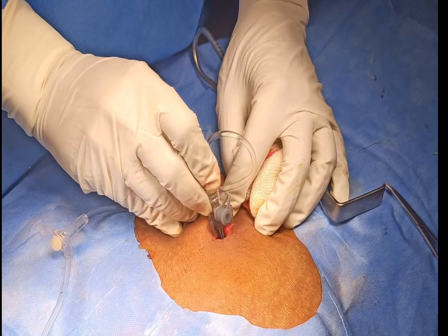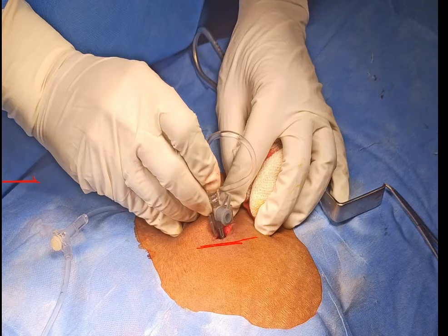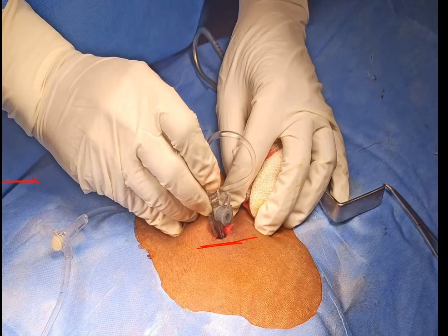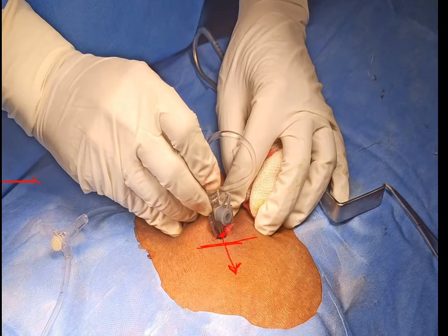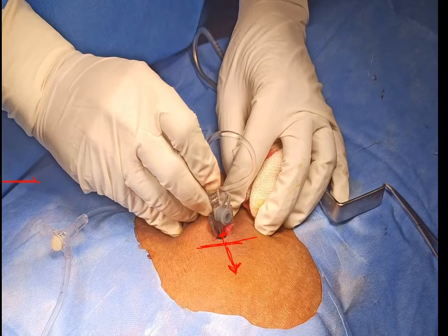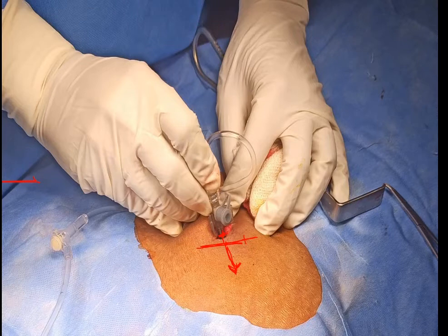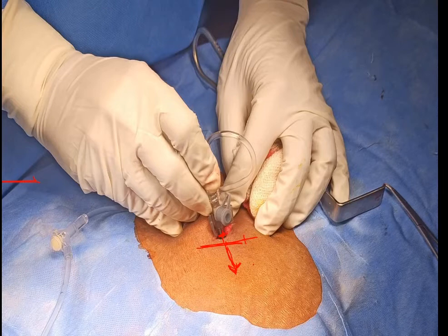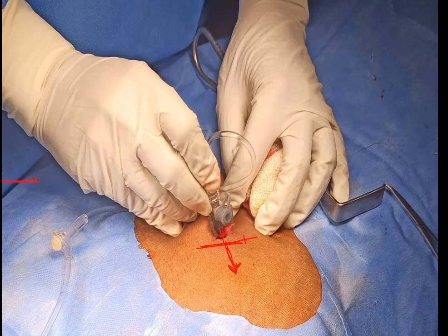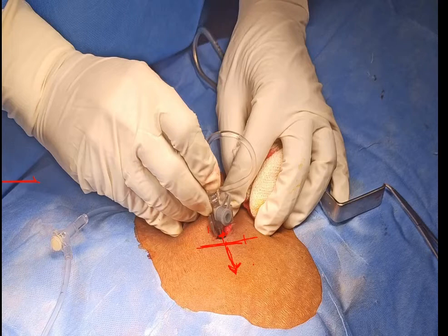Once the rectus sheath is reached, this is a blind procedure. We blindly insert the gray cannula through the rectus sheath into the peritoneal cavity, directing it towards the iliac fossa. The patient must empty the bladder before the procedure to avoid bladder damage. Once we enter the peritoneum there will be a giveaway feeling; at that point we remove the needle, leaving only the soft part of the gray cannula inside.